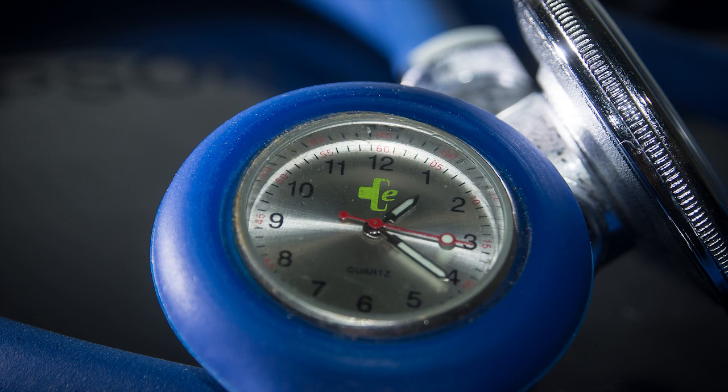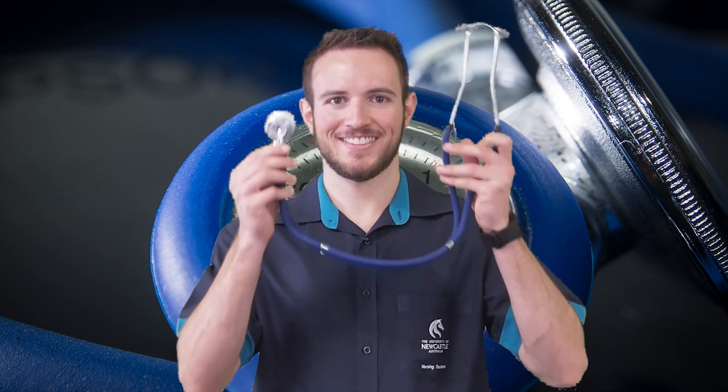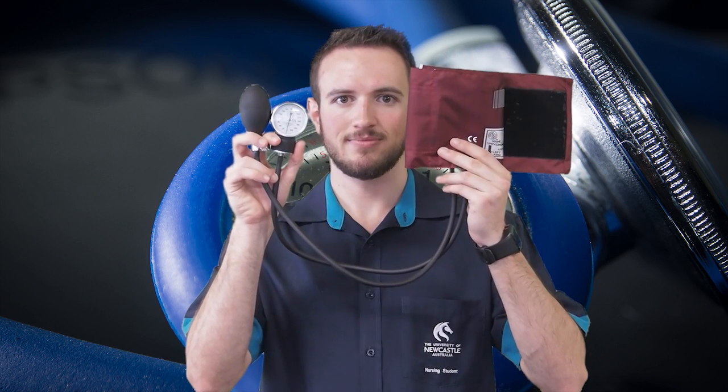The pieces of equipment you'll need for this assessment include a stethoscope and a sphygmomanometer with a cuff, pressure valve and manometer.